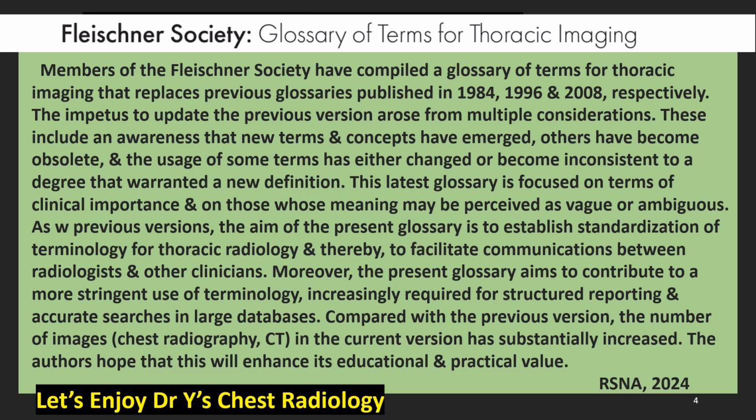These include an awareness that new terms and concepts have emerged, others have become obsolete, and the usage of some terms has either changed or become inconsistent to a degree that warranted a new definition. This latest glossary is focused on terms of clinical importance and on those whose meaning may be perceived as vague or ambiguous.